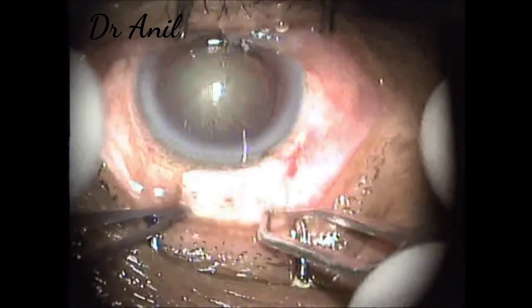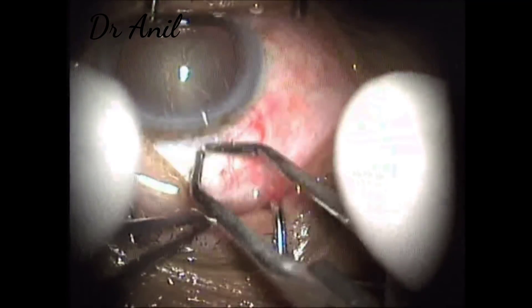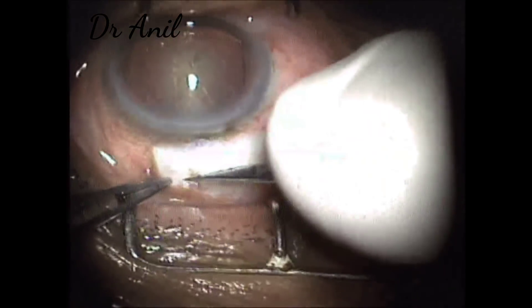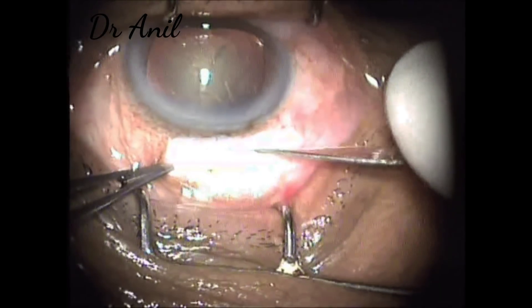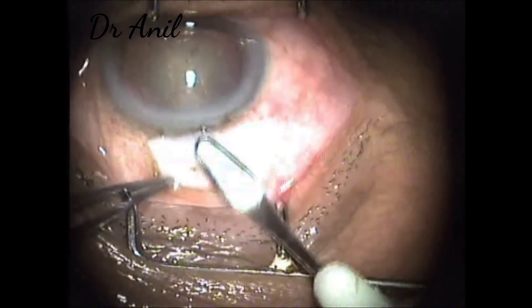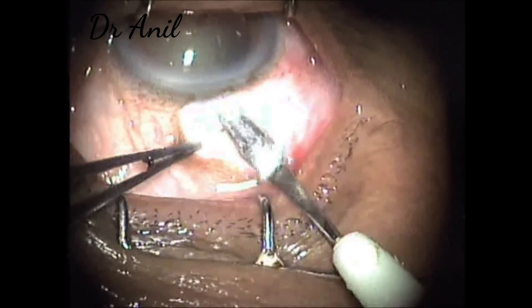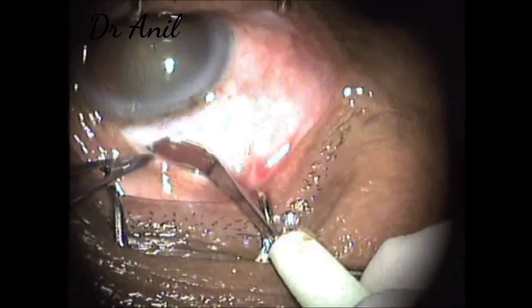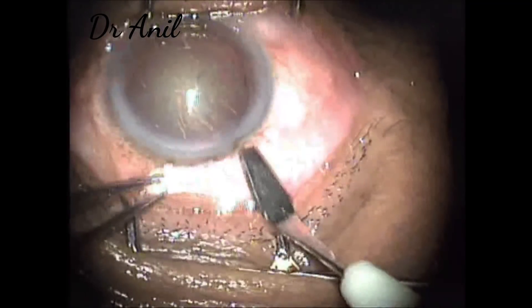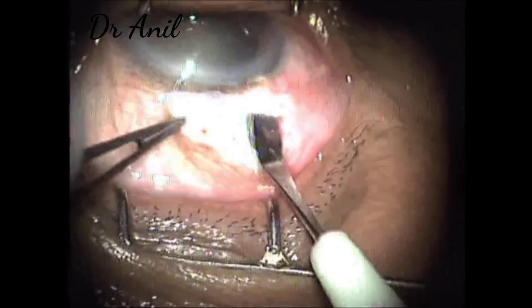Cauterization of the vessels is done with wet-field cautery, taking care not to burn or char the sclera too much. Now the frown incision is made with the 11 number blade. Now this is the crescent blade — just one sweep all around, then taking care going towards the left side of the cornea. When coming out we can just cut a little of the cornea on the left side, the tunnel on the left side. Now the first sweep, the second sweep, and the third sweep completes the tunnel.